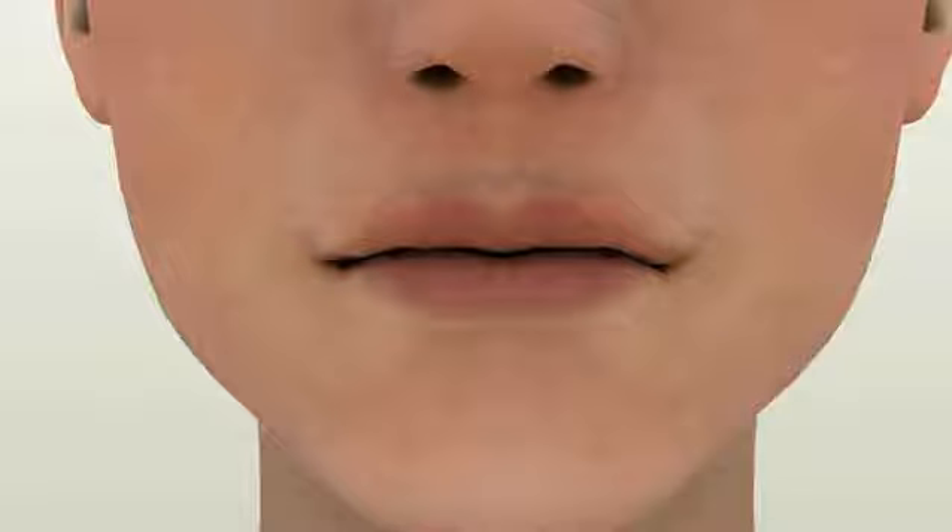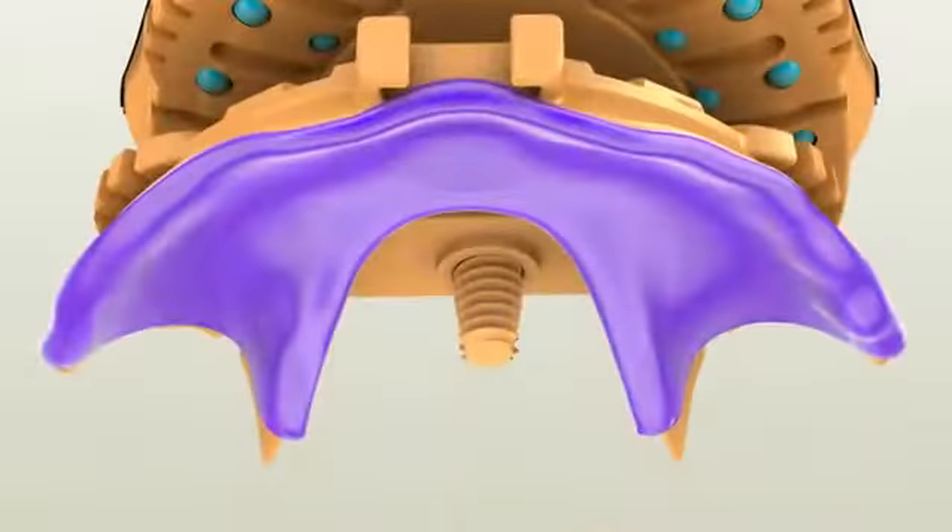If the patient has an existing denture, you can use the existing vertical dimension of occlusion by adjusting the center pin to match the predetermined vertical dimension. If necessary, you may cut the center pin in half to shorten it. After cutting, you can smooth out the protruding pin thread with a slow-speed handpiece for the patient's comfort.